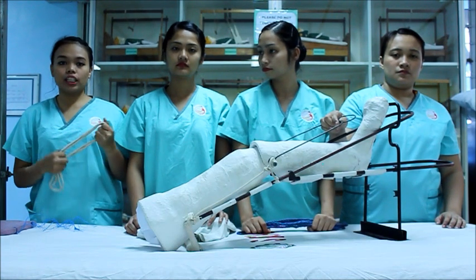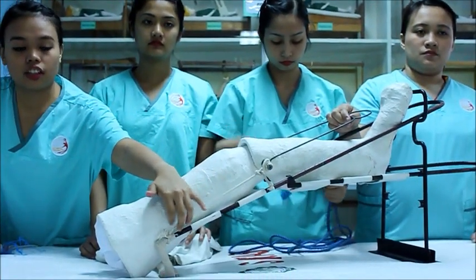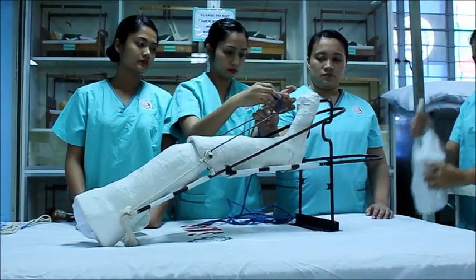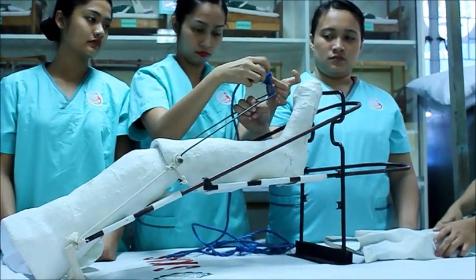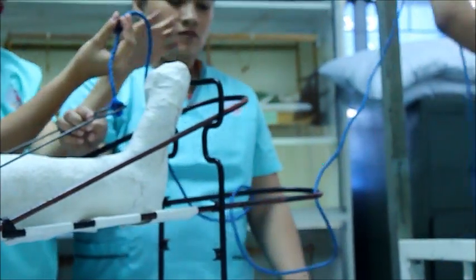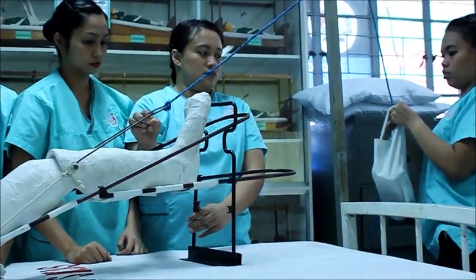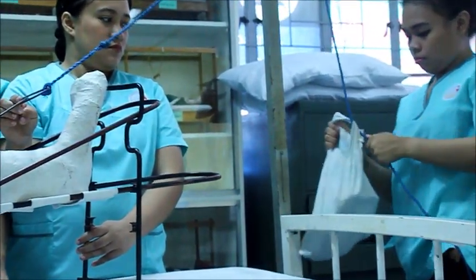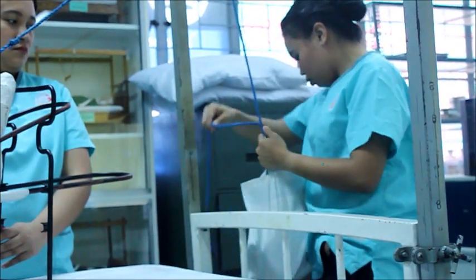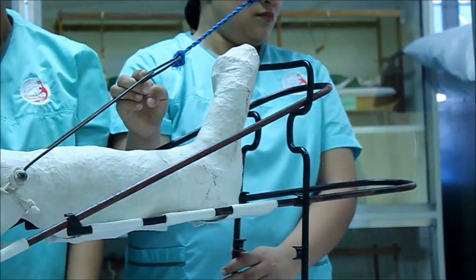On applying balanced skeletal traction, we use three ropes. The longest one is the suspension rope, the longer one is the traction rope, and the short one is the thigh rope which is attached to the Thomas splint. Using a slip knot, tie one end of the traction cord to the stainless steel pin. Then pass the cord through the groove of the third pulley and attach the traction weight bag. The traction weight bag should be 10% of the patient's body weight and should be at the level of the bed.